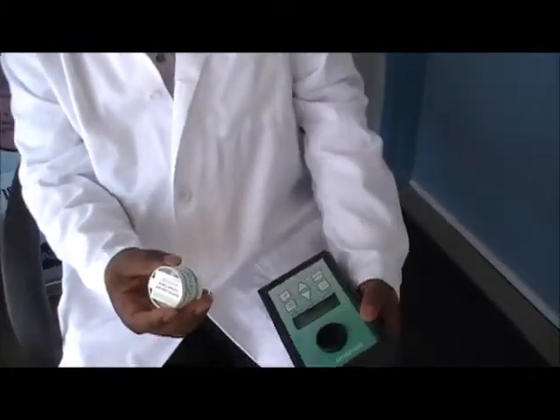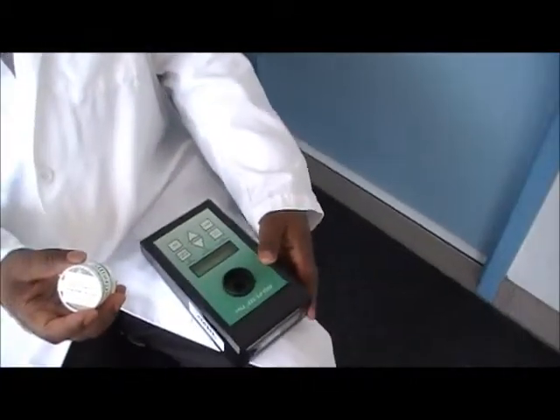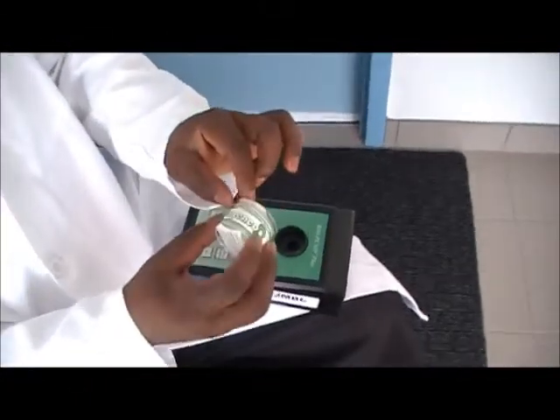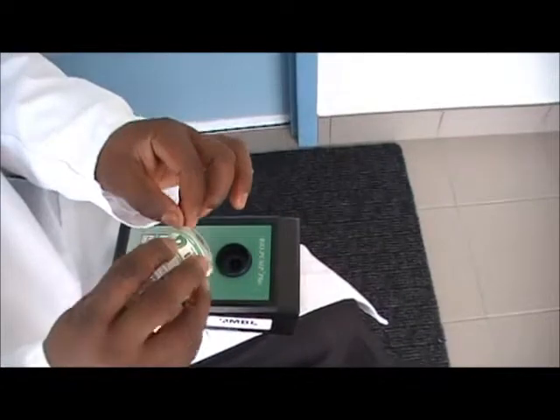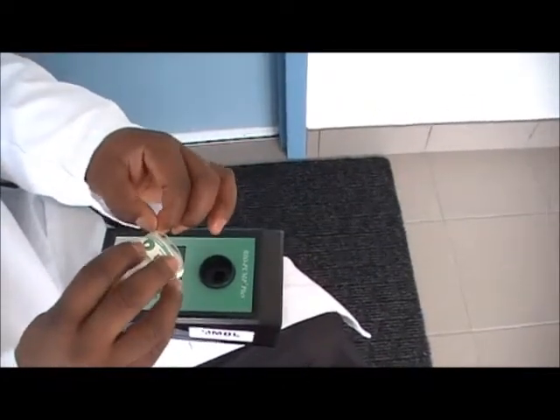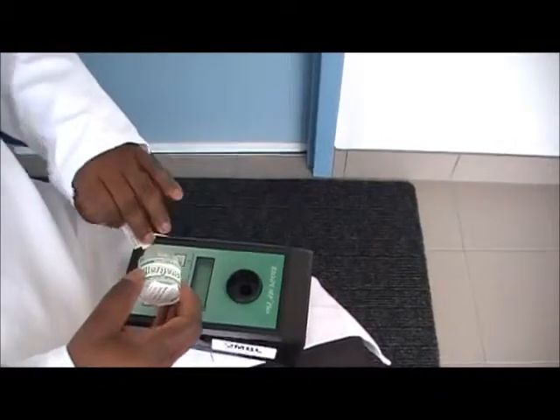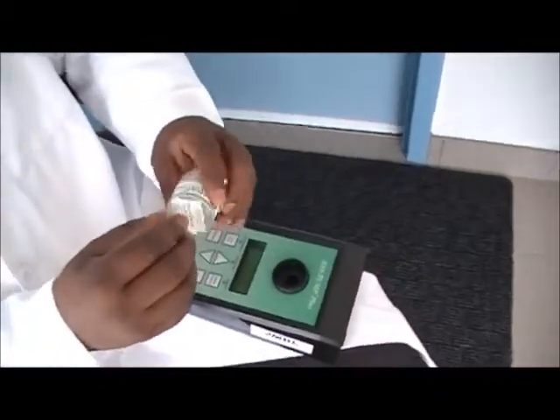All you need to do is set the time that you need to take your sample. The first thing is to remove the stickers which come with the cassette — remove the stickers from both sides. Make sure that you keep the stickers because you need to replace them after you have taken your sample.